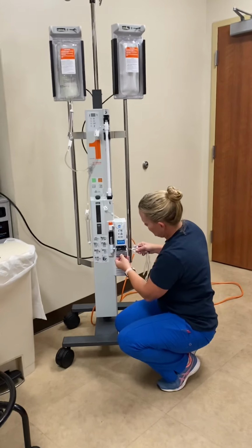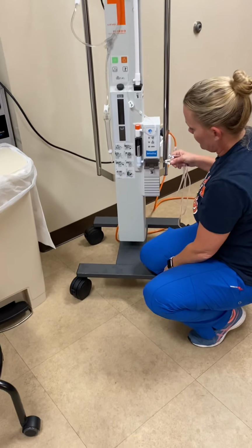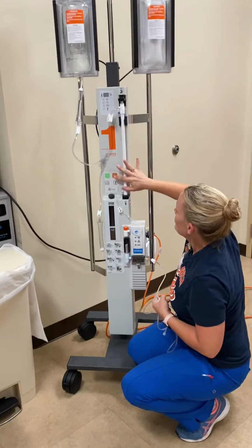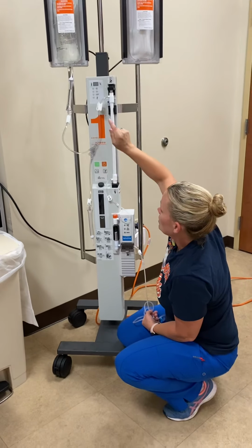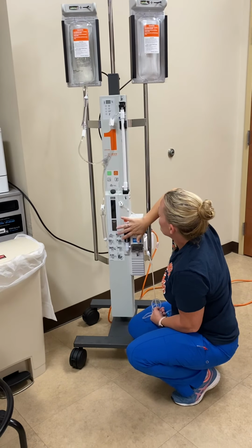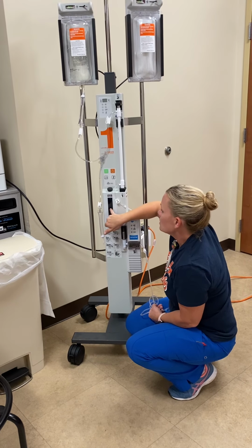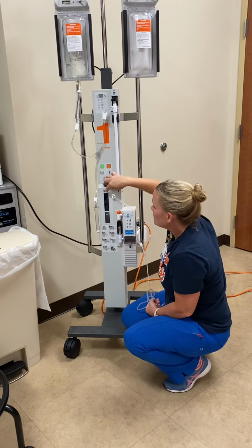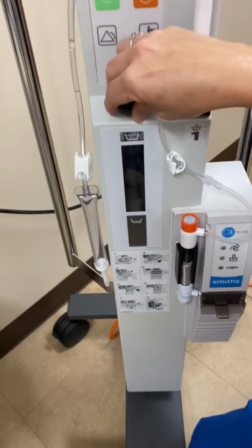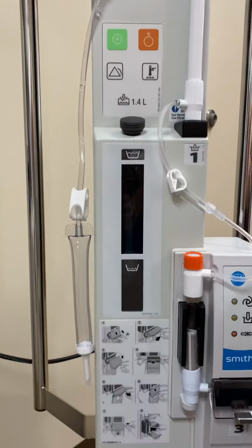Okay. So once you get that in place, you lift it up and push it back down, and the little metal lever will click over it. So at this point in time, everything is as it should be. We're gonna go ahead and turn on the machine. You'll hear the top part, which will be the fast infuse part, come through, and then the bottom part will kick in as well, and that's gonna be the warming section. You should also see bubbles here. This is where your distilled water goes. There's a little dipstick, like when you check your oil, and you can look at the dipstick, or you can see the levels here.